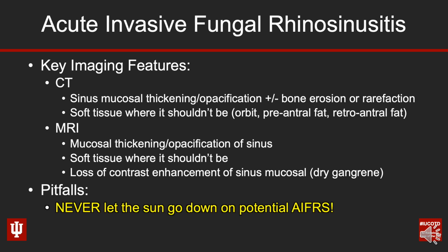I want to stress to you, as I have already, but I'll say it again, never, ever, ever let the sun go down on these patients with potential acute invasive fungal rhinosinusitis. If you're doing third shift, you're reading inpatient studies overnight or ER patients overnight, and someone comes in with a sinus CT, absolutely put eyes on it. Make sure they don't have acute invasive fungal rhinosinusitis.